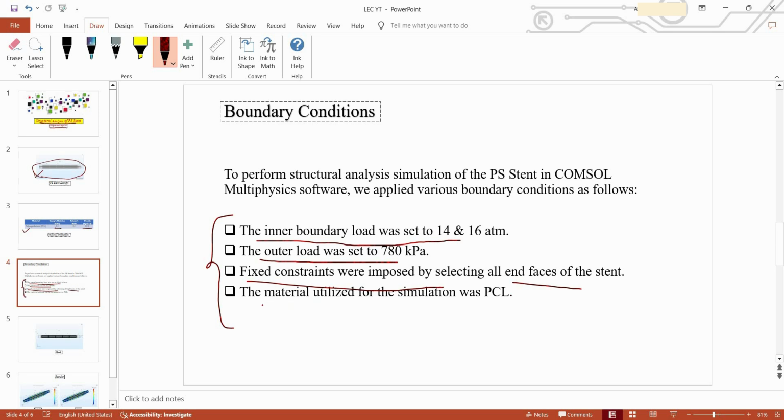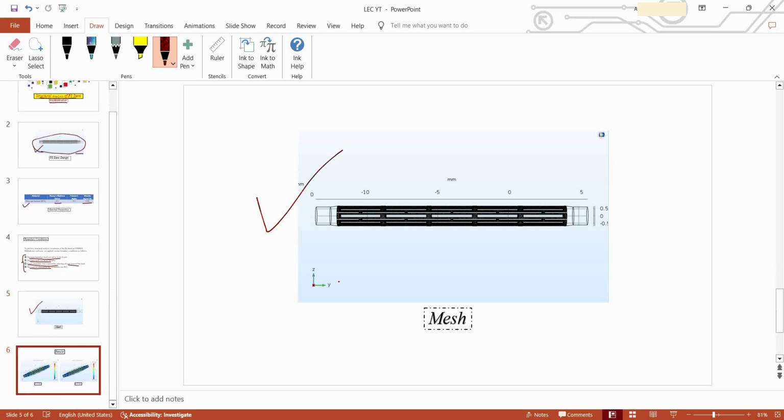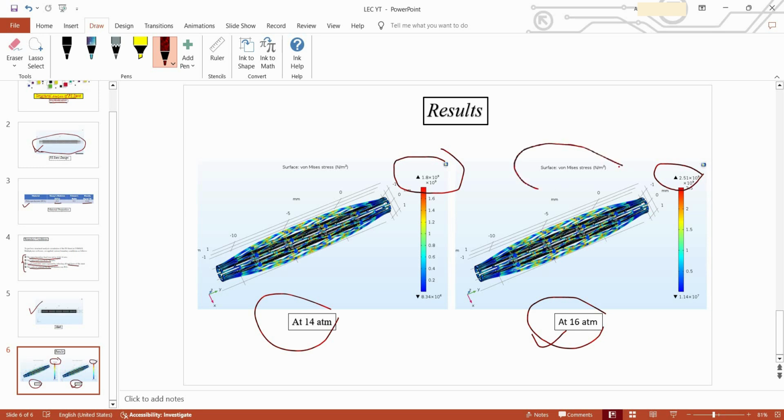As I mentioned earlier, we are going to use the material property of the PCL. This is the mesh geometry. We have used extremely fine meshing for the stent. After following all these things, we computed the results and got these surface plots for von Mises stress at 14 atm and at 16 atm. At 14 atm we got 1.8 into 10 to the power 9 Newton per meter square von Mises stress, and at 16 atm we got 2.51 into 10 to the power 9 Newton per meter square von Mises stress.